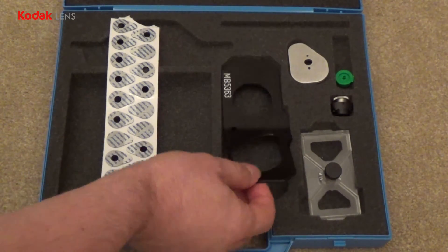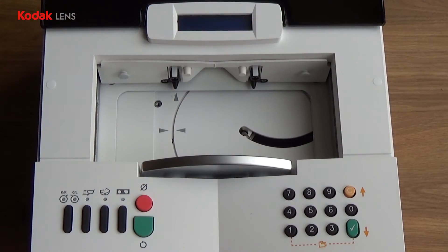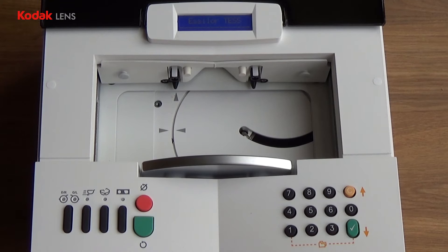To calibrate the test tracer, you will need the black calibration gauge. To turn the test tracer on, press the power switch on the right side of the tracer until you hear the beep. The tracer will take a moment to initialize.